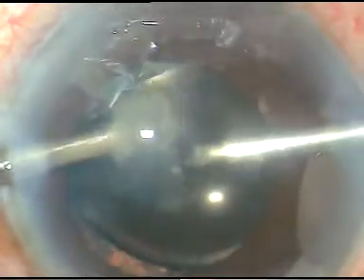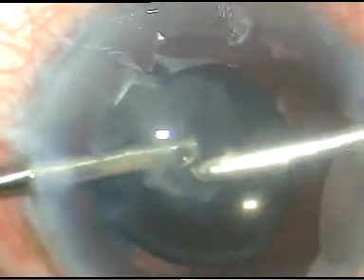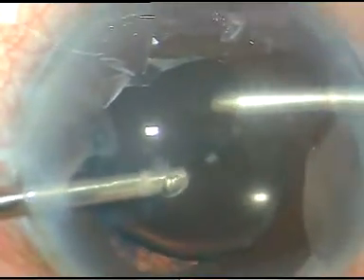Since there is no ultrasonic energy, I have to be slow and patient in removing all the epinuclear material.